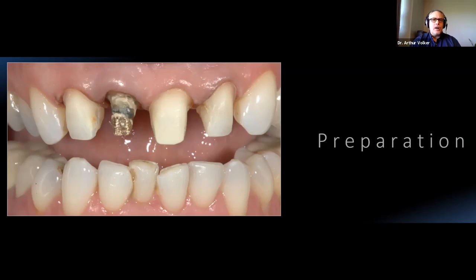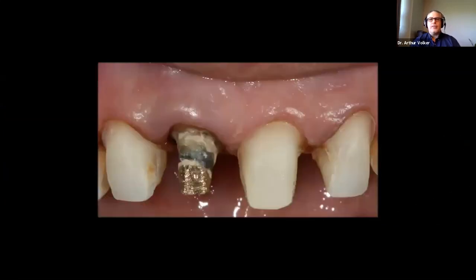Now, I'm going to show you an up close. I think I have it next. Let me see. Yeah, let me show you this right here. Take a look at tooth number 8, right? We have this very, very dark area. But I also want you now to take a look at tooth number 9, or the 2-1 if you're watching us from overseas. Look at the mesial margin. You see how it can be very, very thin? Because it was super clean, super clean. There was nothing there. It was basically a virgin tooth.